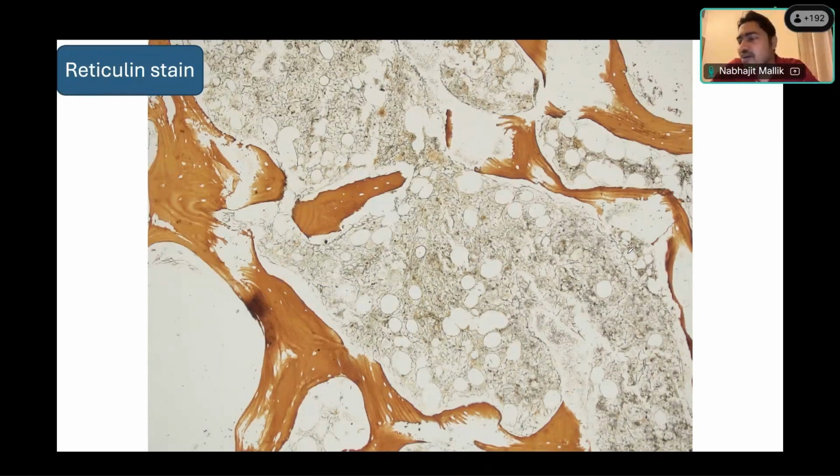So now we have a lot of information about this case. Ekta, what do you think our diagnosis is here, or at least a differential diagnosis? Do you think we are dealing with a myeloproliferative neoplasm? No, sir. I'm sorry, could you be louder? Not sure, sir. Okay, Jasleen?